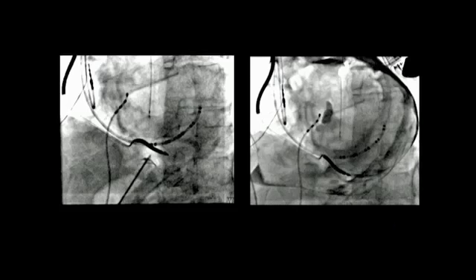Our technique is largely the same as described by Dr. Sosa and Dr. Scanavacca for VT, which we use today. You can see in the left image the percutaneous needle in a subxiphoid approach. We typically use a posterior approach for access. The image on the right shows, after we've gotten access, a pericardiogram showing nice free fluid movement in the pericardium to ensure that we haven't gotten into a cardiac structure prior to putting in the larger sheath.